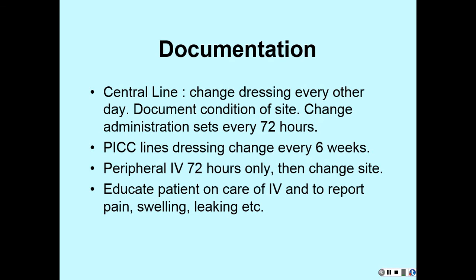Okay? You always are going to document the condition of the site, and we're changing central line tubings every 72 hours. PICC line dressings are changed about every 6 weeks, or unless they just get nasty and you can't stand it anymore, because they tend to be a little messy sometimes.